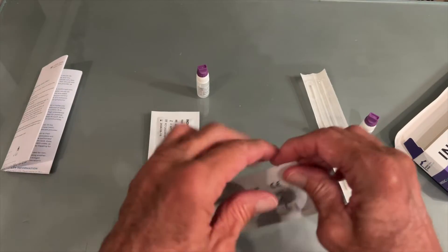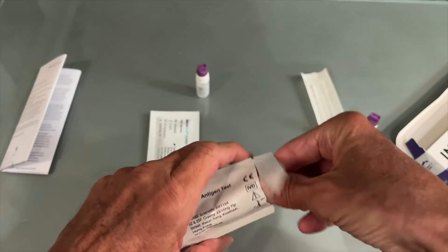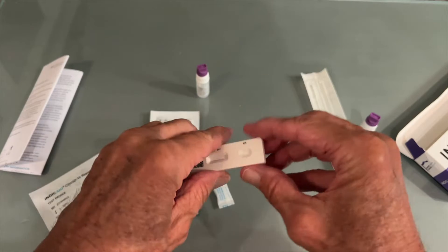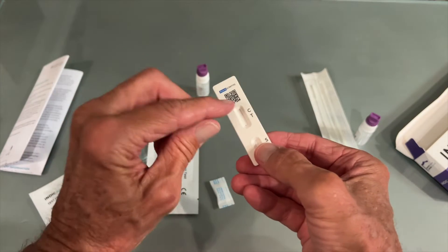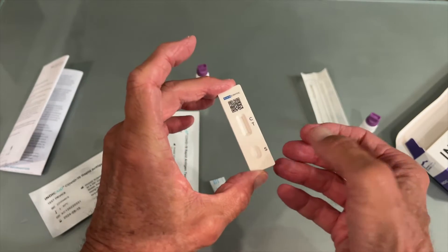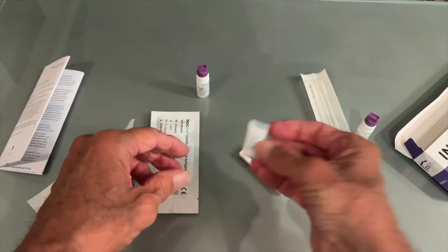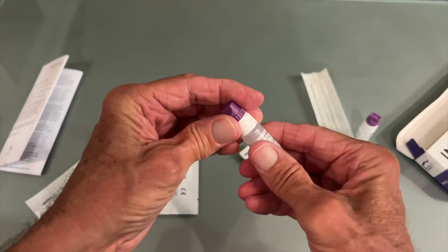The first thing you want to do is get your test device out, so let's pop this sucker out. Here's where you're going to put your solution — right there. That's your control, that's your test. If this one comes up, you're in trouble. Let's set it down.